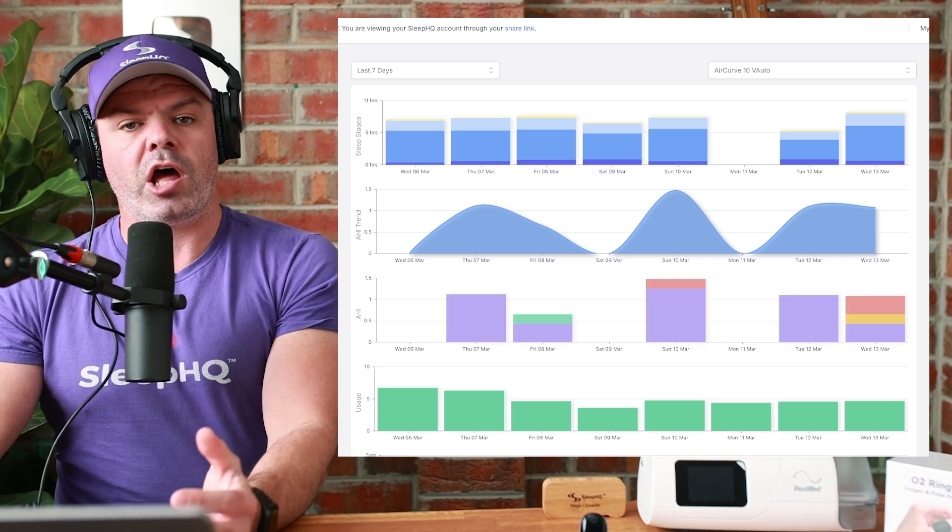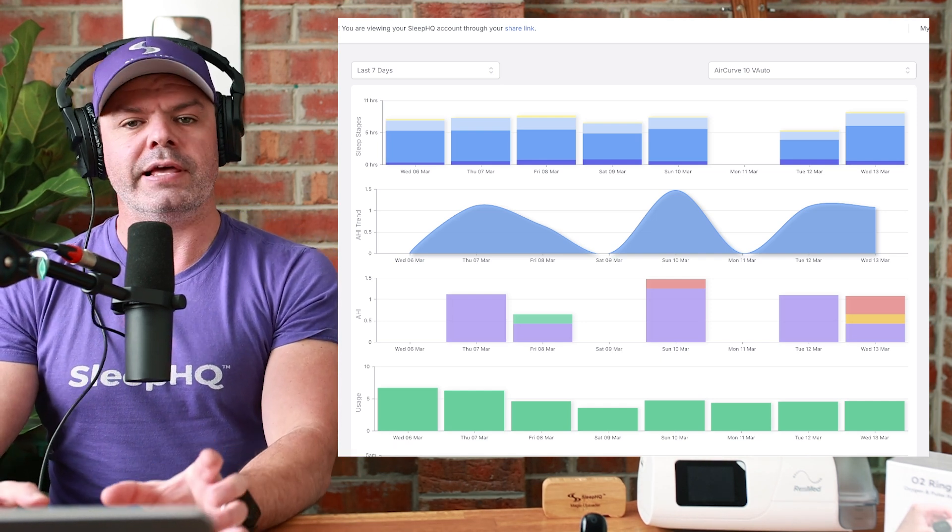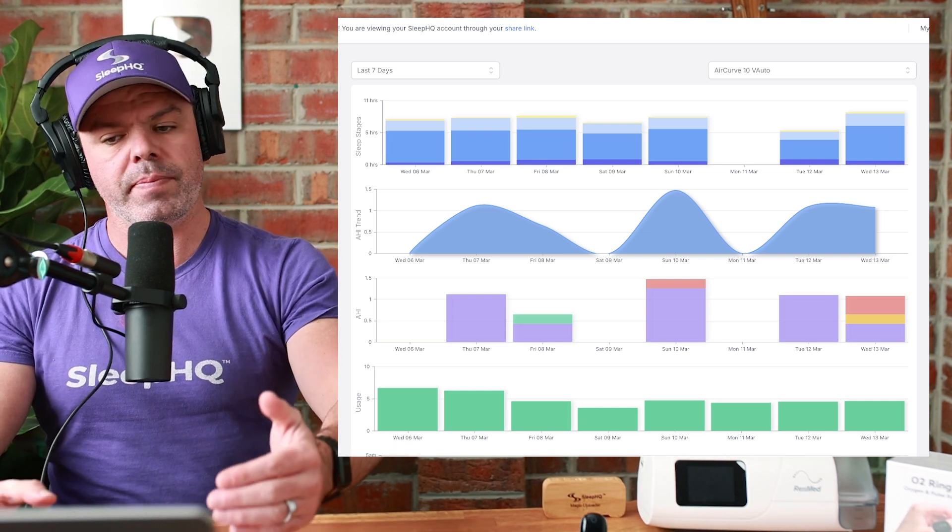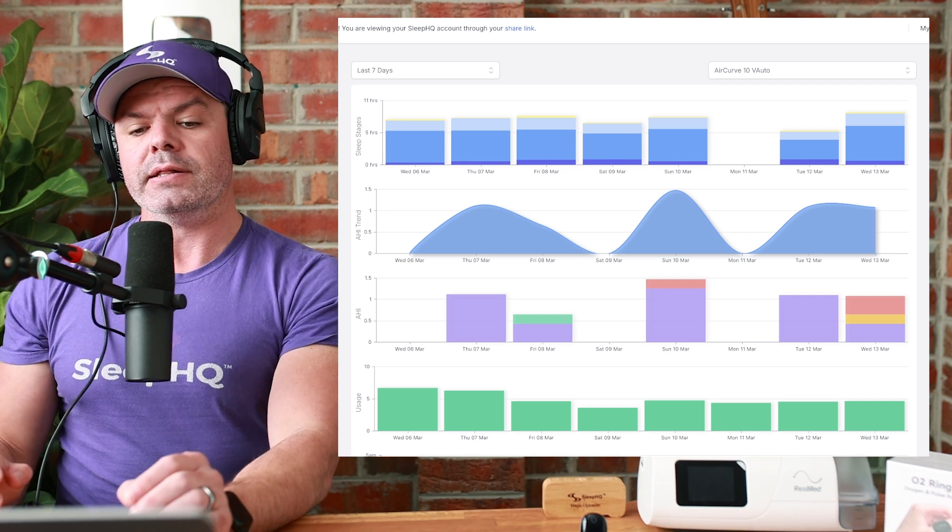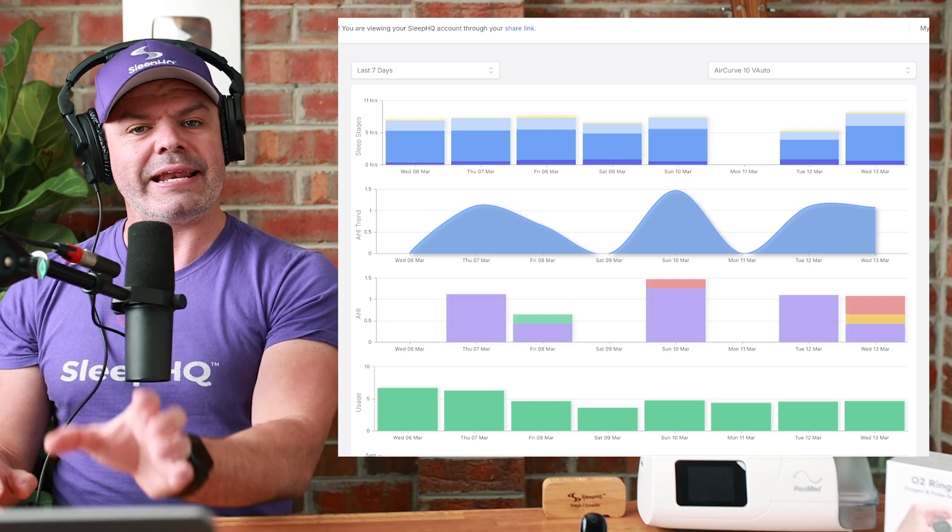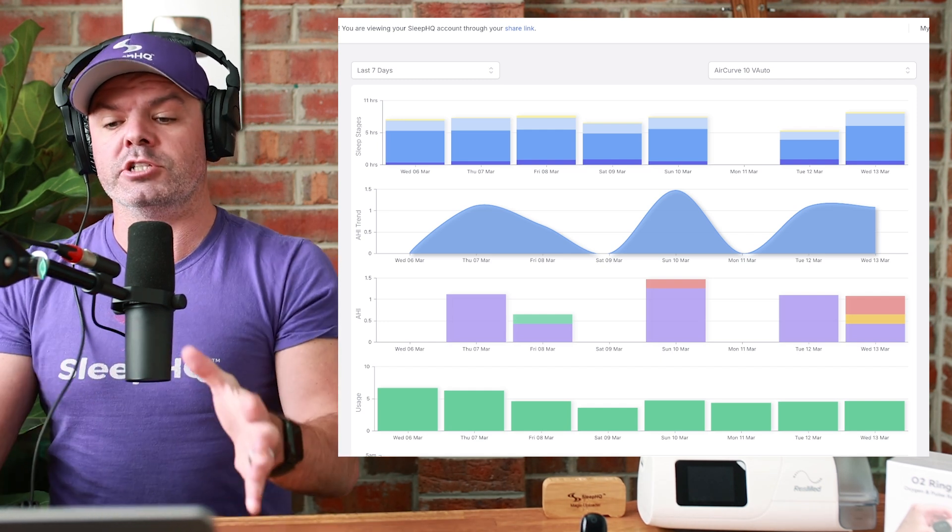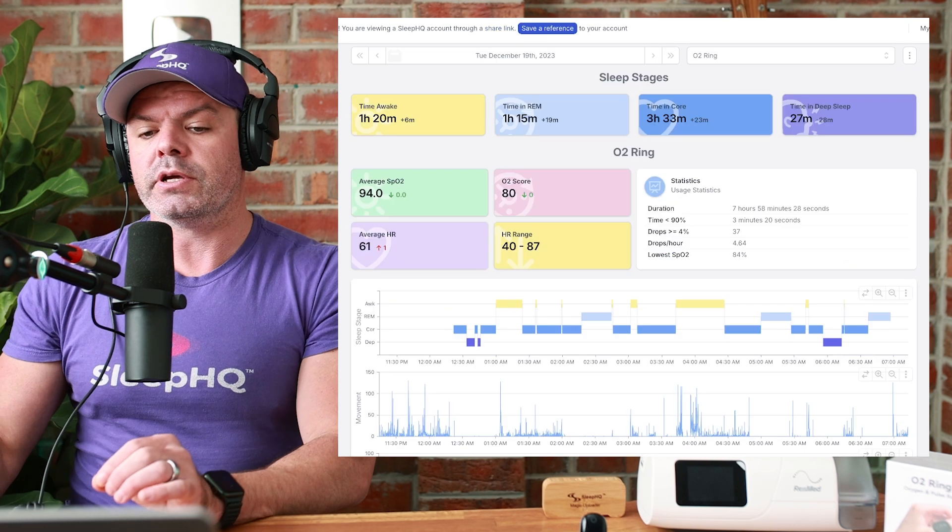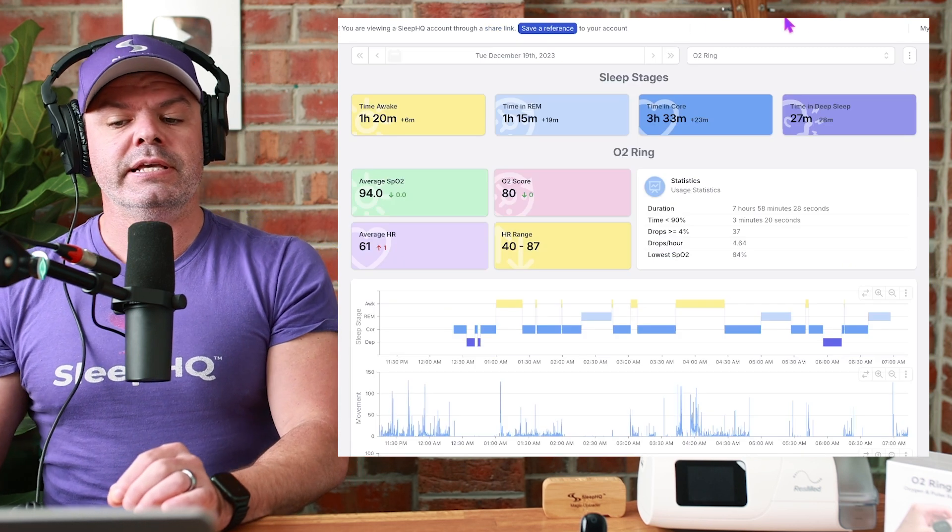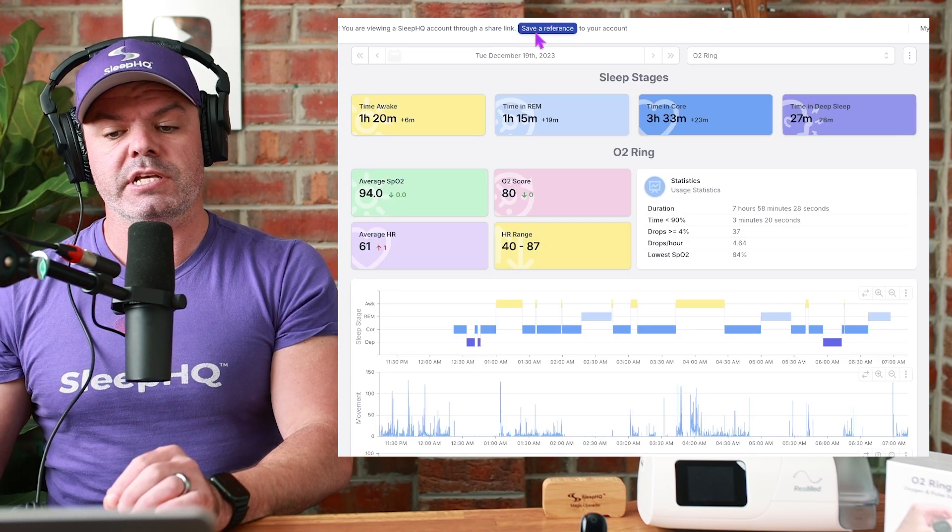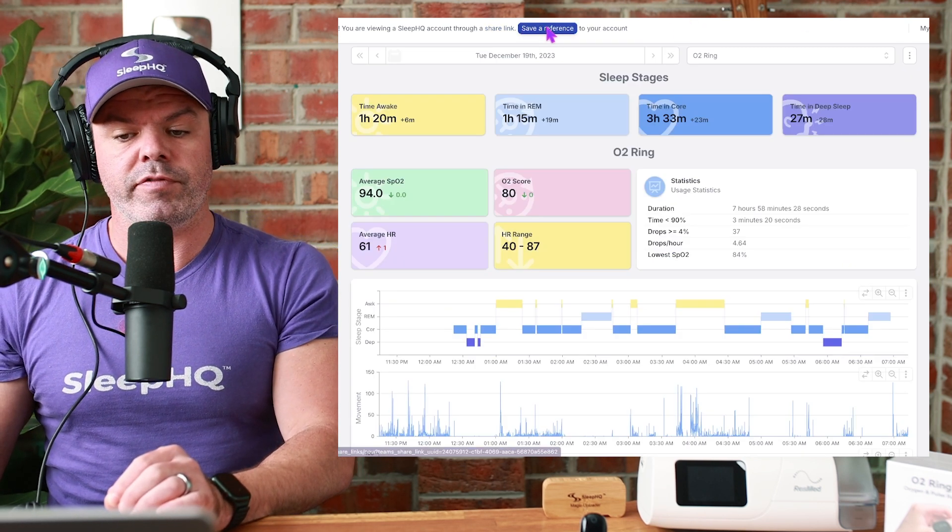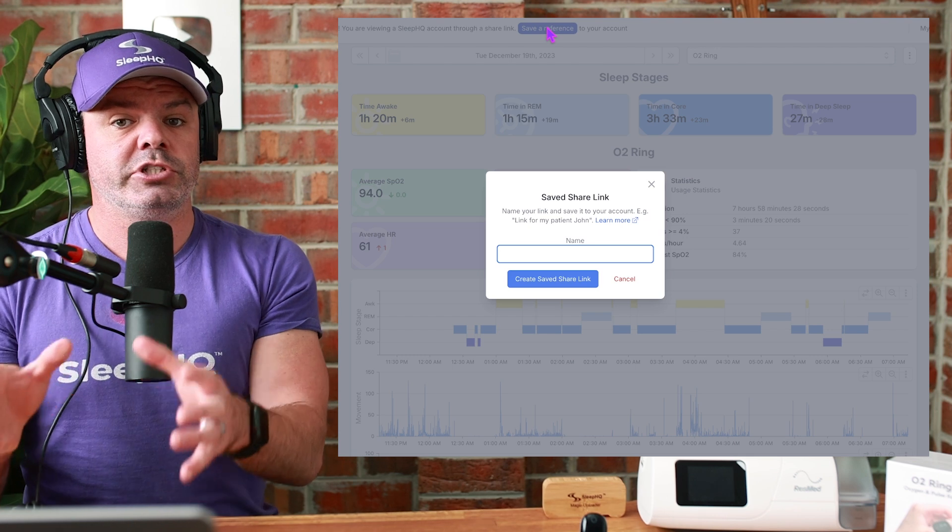Now, let's just say like before, Stuart's helping out Leslie with some feedback, with some advice. And Leslie provides an account level share link with all her charts. What Stuart can do is he can save a reference. See up here? Save a reference to her account level share link.